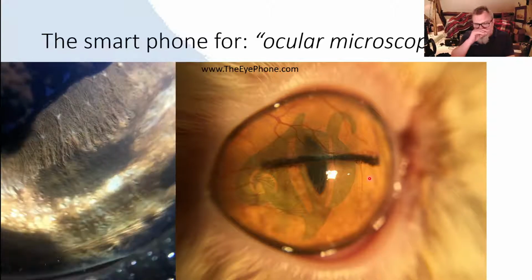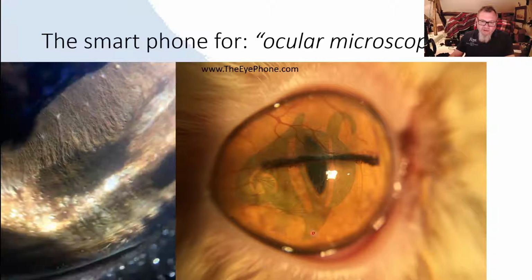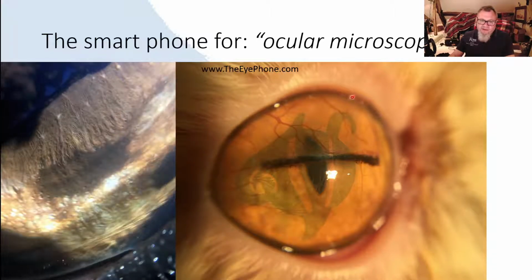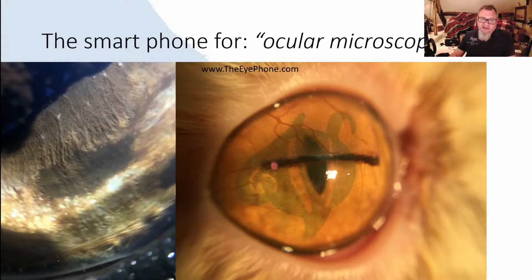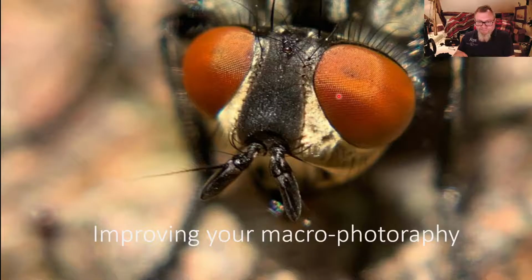This right-hand picture is a picture of a contact lens and a corneoscleral transplant we've done in a cat. So this bottom half here is transplanted cornea. The top half with the blood vessels is the conjunctiva, which is part of the same graft, and the dark area is the limbus, which started its life up here.